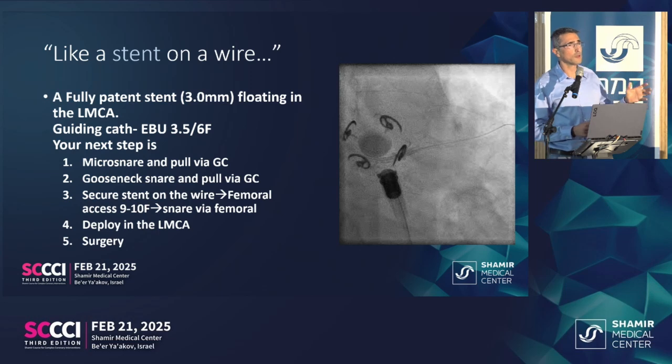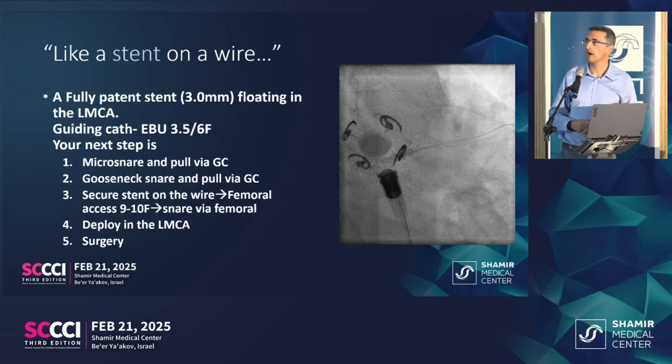Or we should just go from a femoral approach, deploy the stent in the left main as an option, and maybe the best option in town, just send the guy for surgery. All right, so just vote for a sec, and we'll see how we can push this case through.